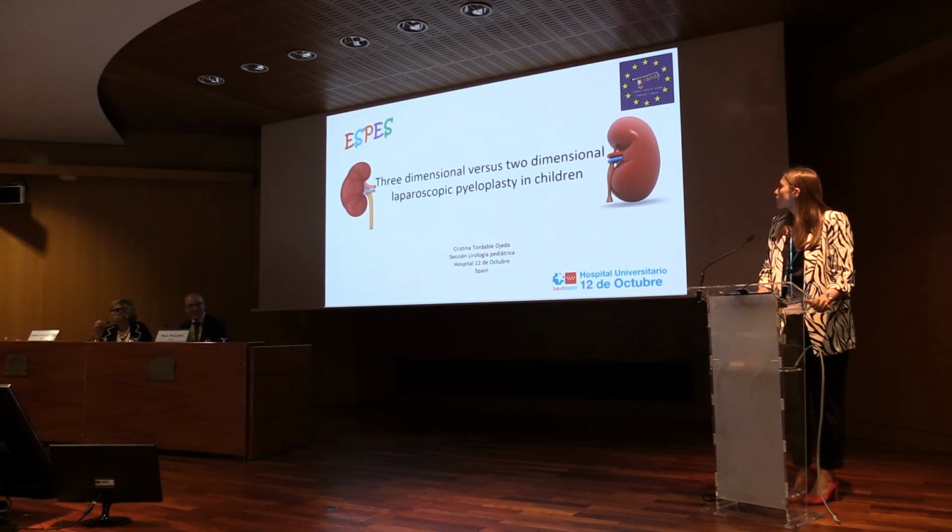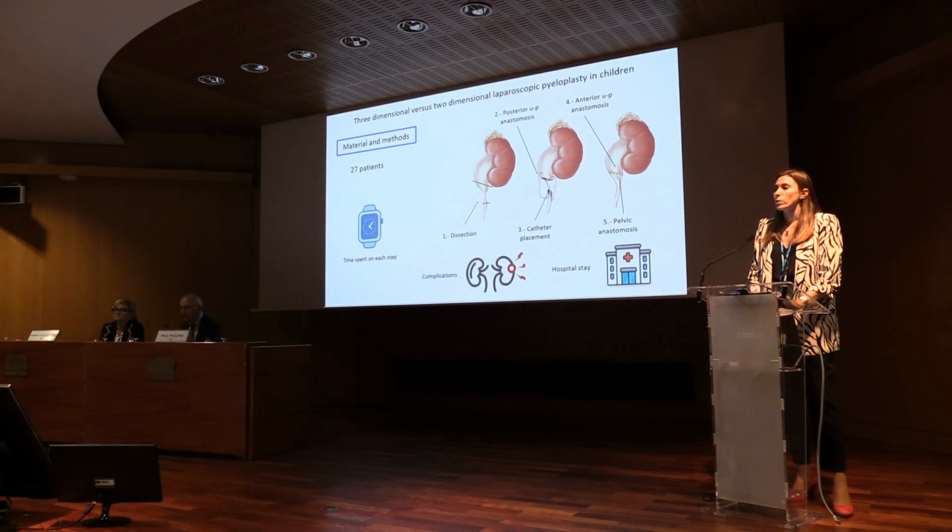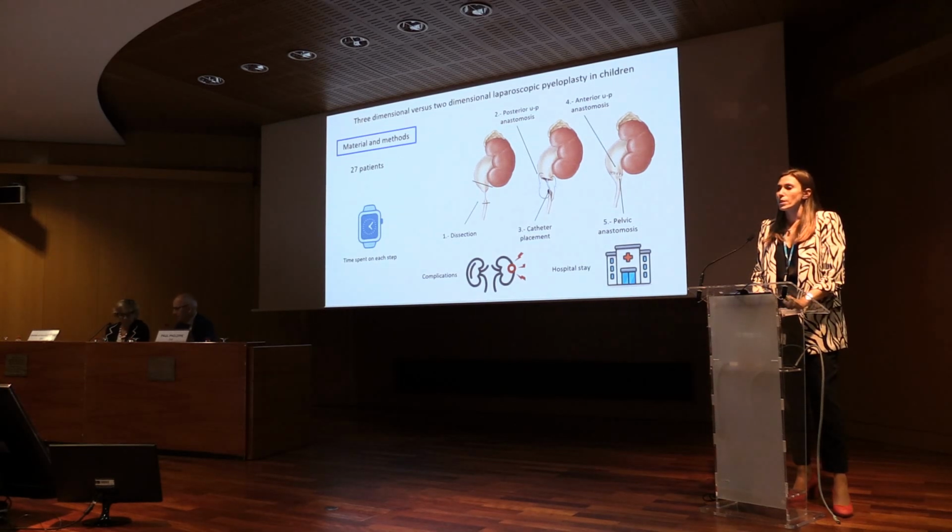Good afternoon. Three-dimensional laparoscopic devices were designed to overcome the technical difficulties that we find in 2D. So we must know the technical improvements that they really bring us. For this reason, we have carried out a study of 27 children who underwent laparoscopic pyeloplasty.